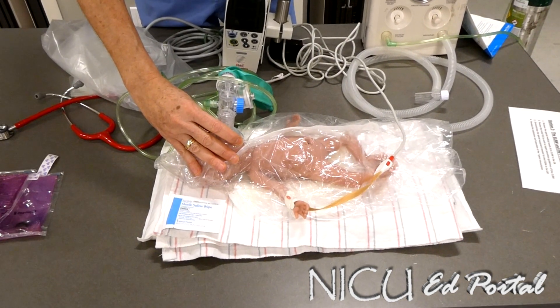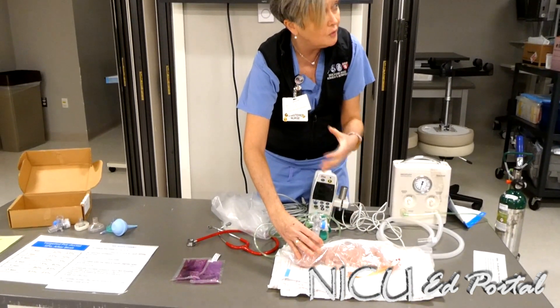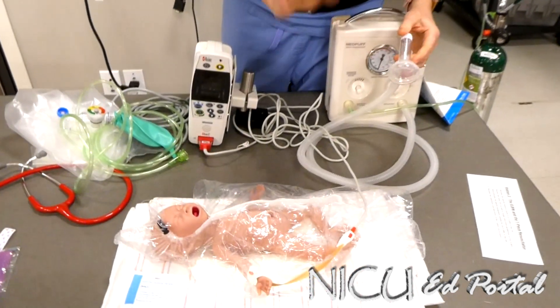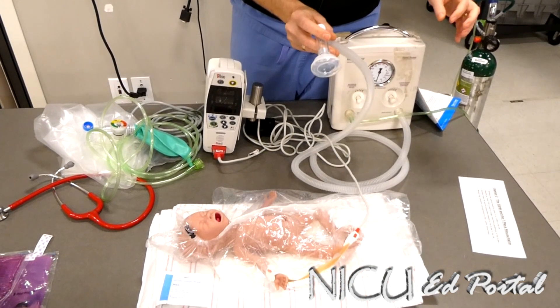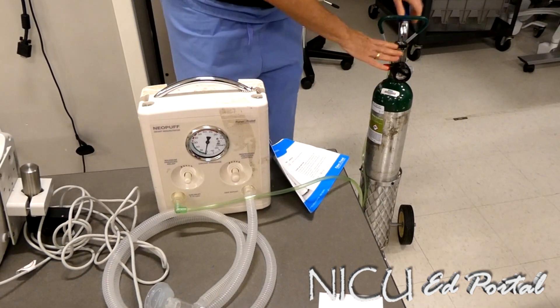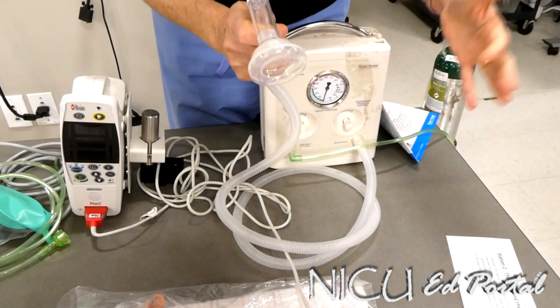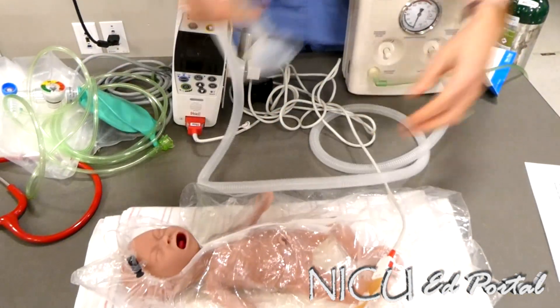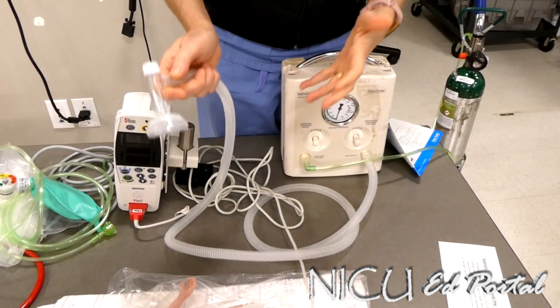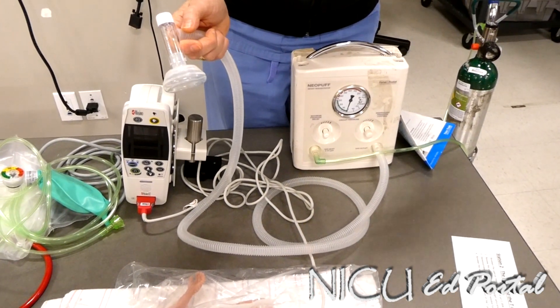This is an anxiety-provoking situation, and I'm guilty myself of over-pressurizing the bag and going above the pressure needed. With the introduction of the T-piece connector, we've been able to set the CPAP and the PIP that this baby is going to get right from the beginning. Let me turn on the oxygen. There are two important things: one is the CPAP pressure — the continuous positive airway pressure the baby gets when the mask is in place. The other is PIP — the peak inspiratory pressure. If I'm resuscitating a baby this small, the maximum PIP I want to give is 20, and the maximum PEEP is 5. So we say the baby is 20 over 5.